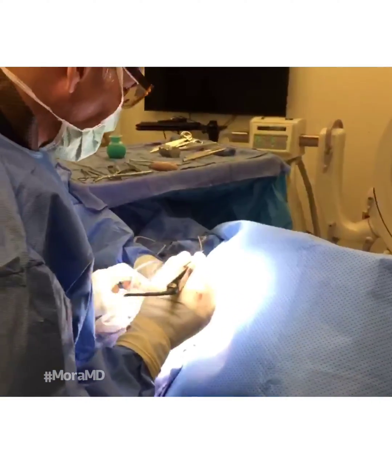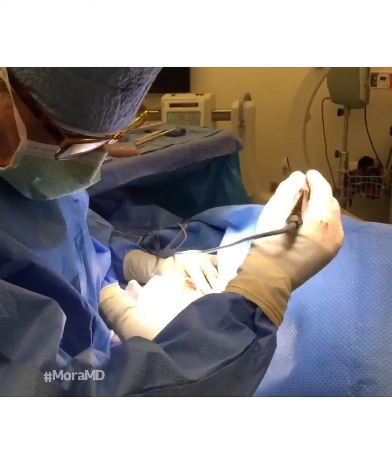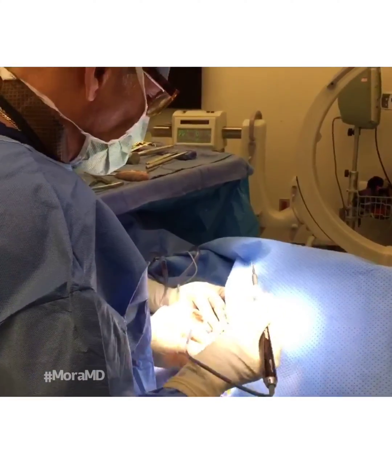We're doing some hardware removal today, and we've got to pull out the high-speed metal burr to get this out — but we're almost there.